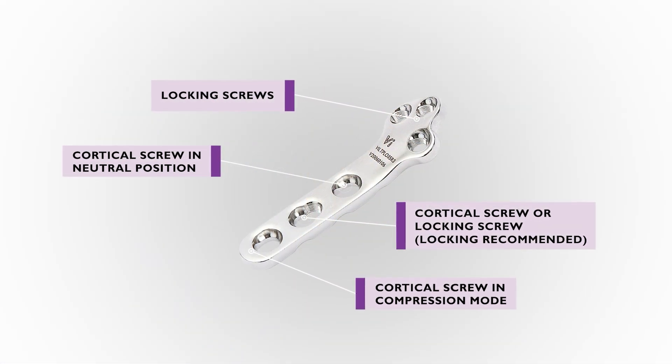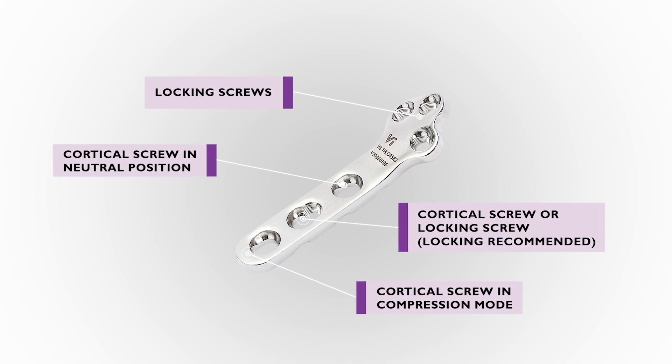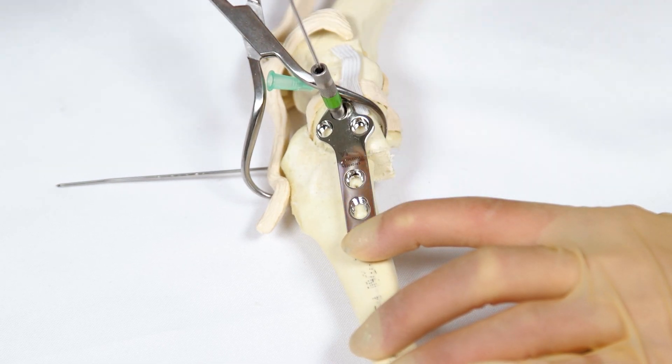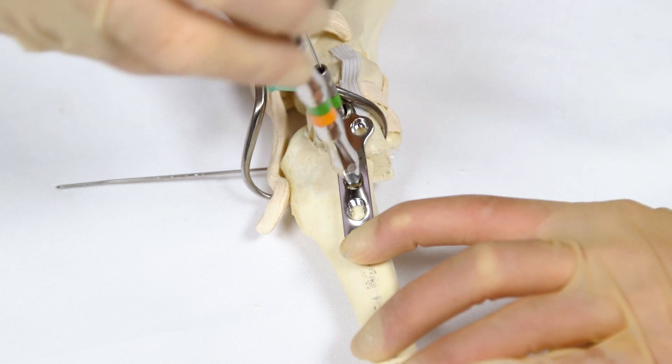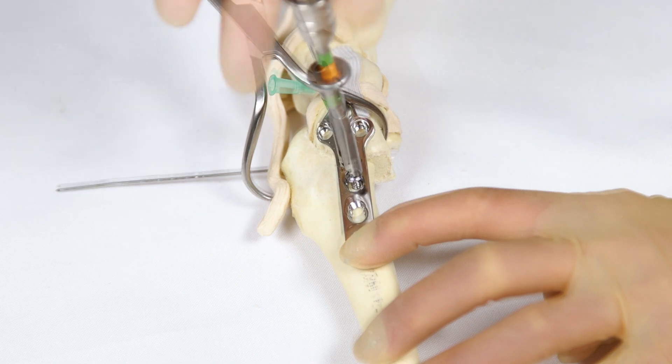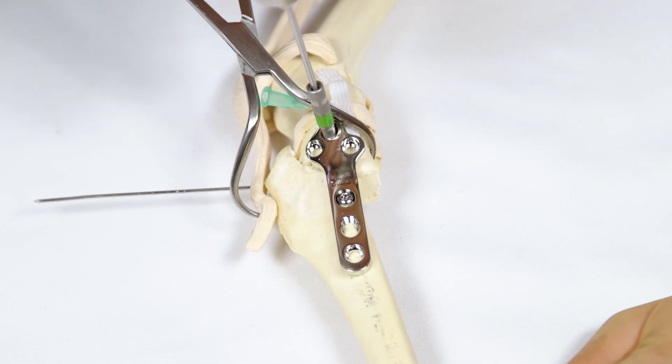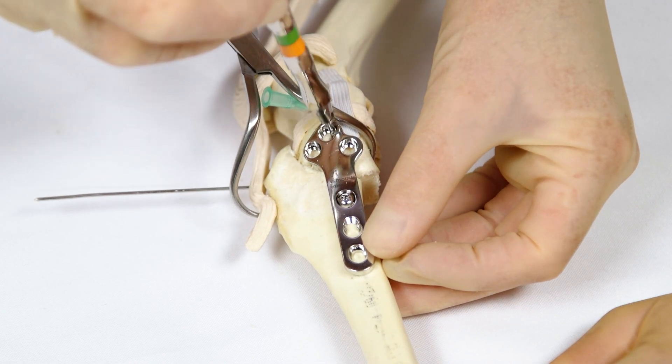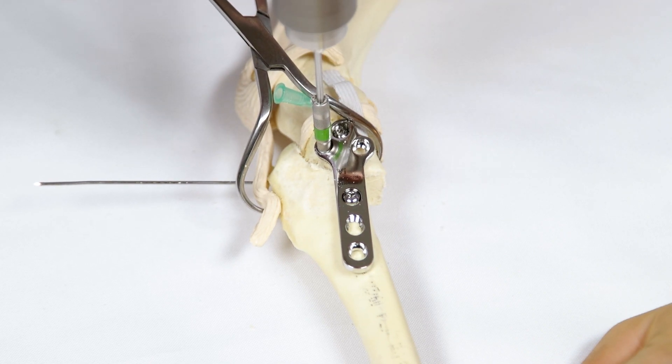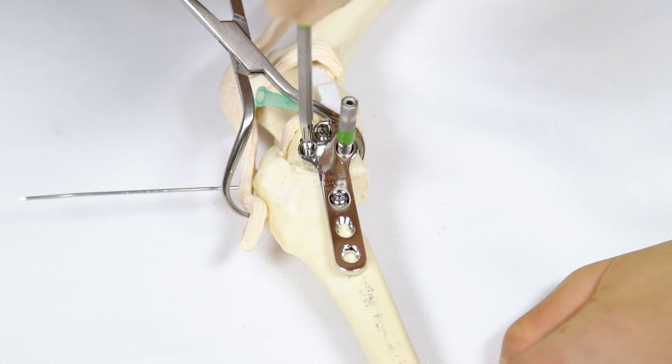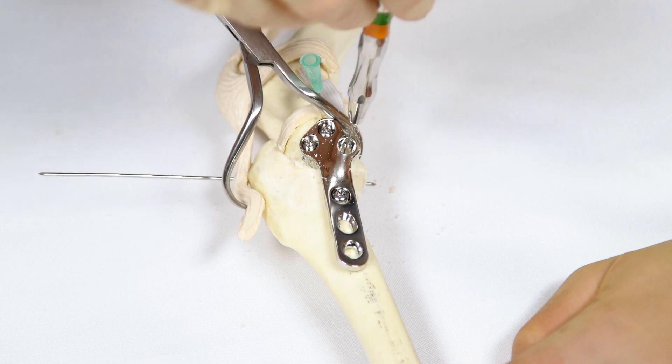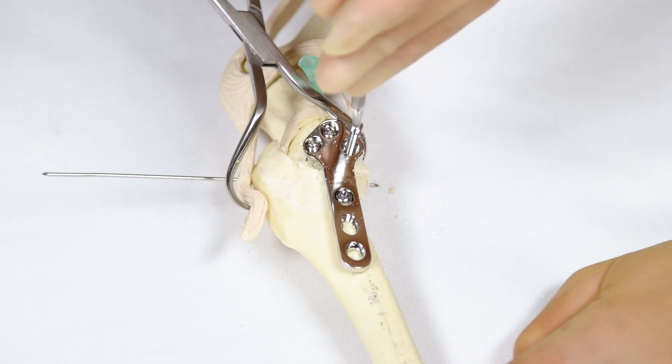The order of screw placement in this type of locking TPLO plate is very important. The first screw is placed in the proximal hole of the straight section of the plate over the tibial diaphysis. This is a non-locking screw and is placed in the neutral position. The head of the plate is then secured to the tibial plateau using locking screws. A locking screw drill guide must be used to ensure that the pilot holes are drilled at the correct angle relative to the plate. This is important to ensure correct and secure engagement of the plate screw locking mechanism.